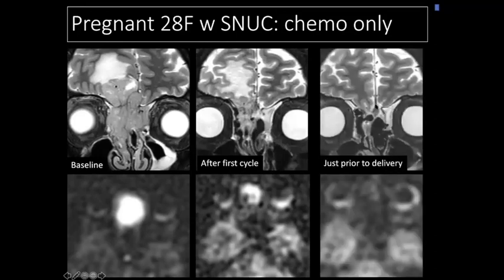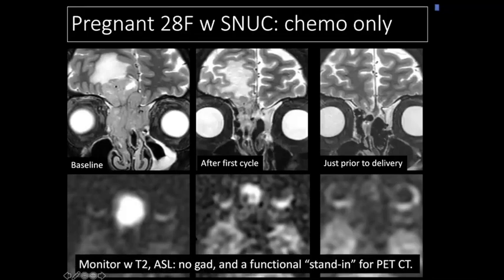Just prior to delivery, she looks dramatically improved on her routine T2 imaging, and on ASL, we no longer see a hyperperfusing mass lesion. So in this particular case, we were able to monitor this patient with T2 and ASL. No radiation, no gadolinium, a functional stand-in. ASL served as a functional stand-in for PET-CT. This patient delivered her child. She was then able to go on to get consolidative chemoradiation and has done extremely well.